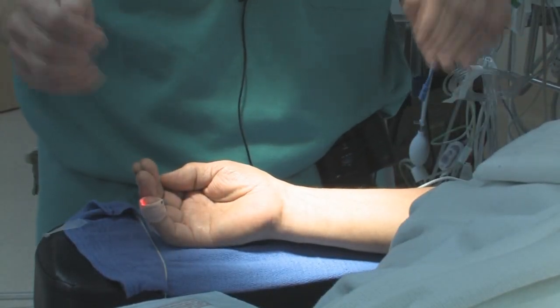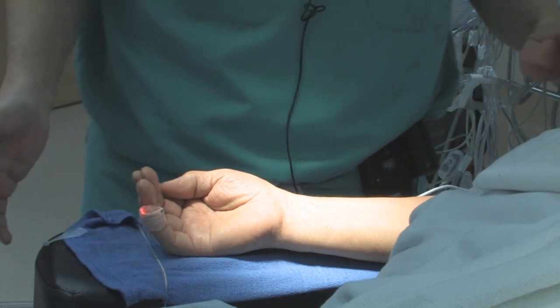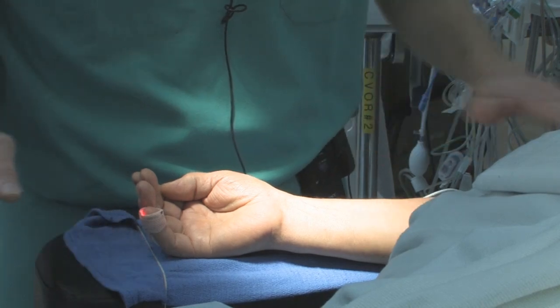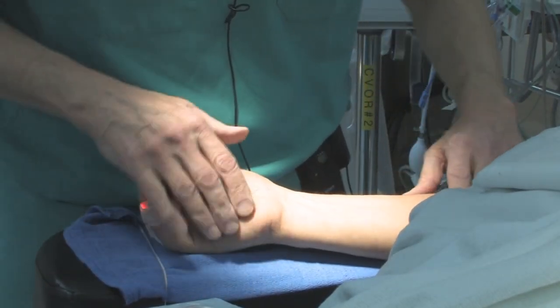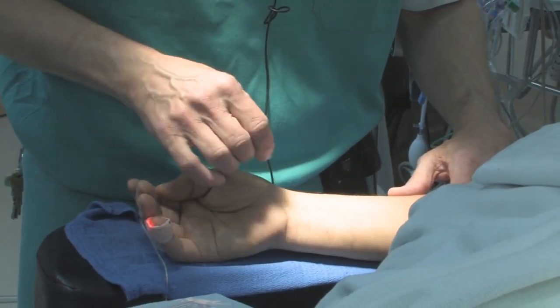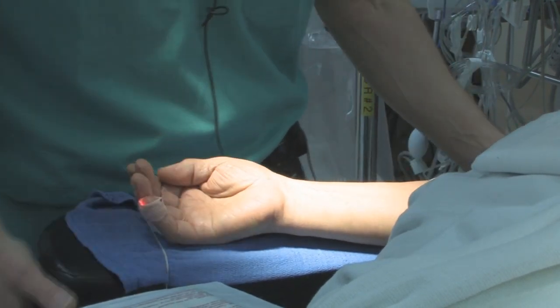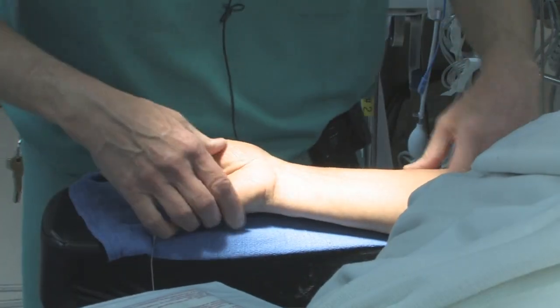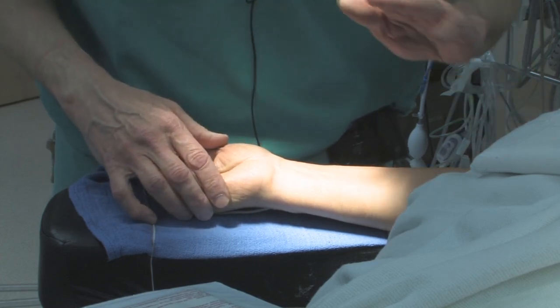We're going to go over how we insert the arterial line here in cardiac under sterile conditions. First of all, you want the patient's arm to be parallel to the table. A lot of patients have a tendency to pronate, and if you're pronating you're not really over the pulse. To maximize your success, get the hand parallel to the table — that may mean you have to externally rotate the patient's arm or move the arm board.